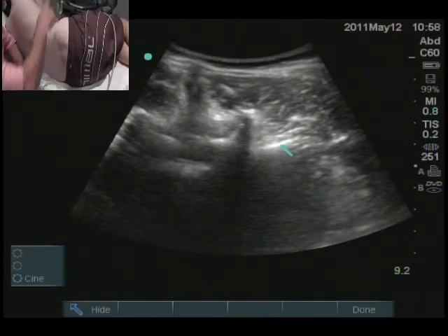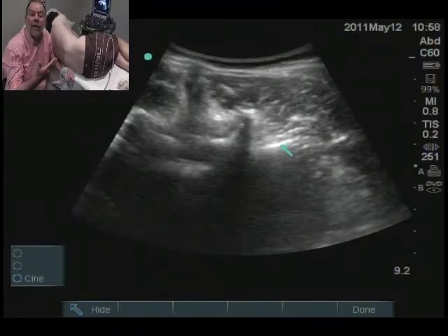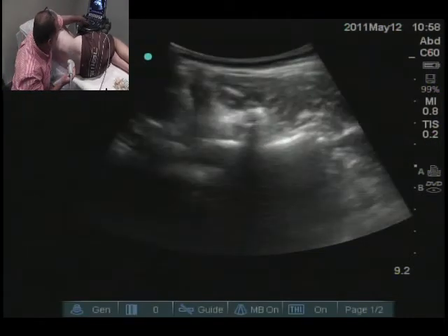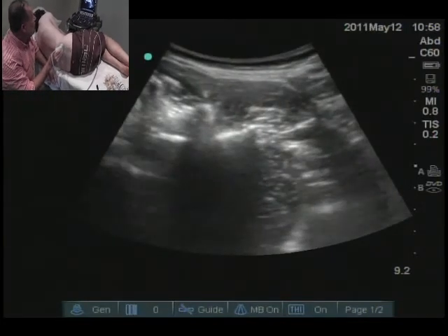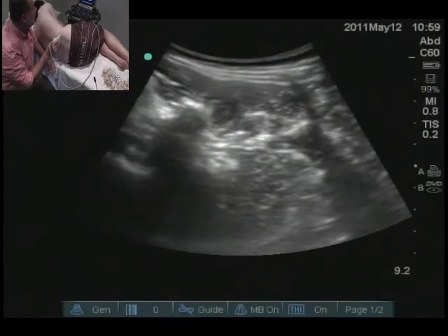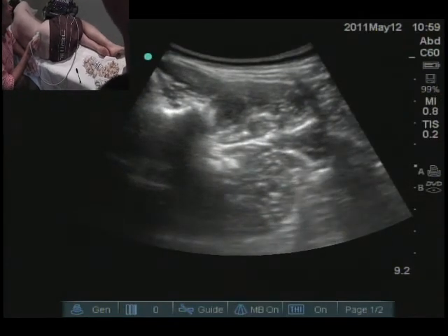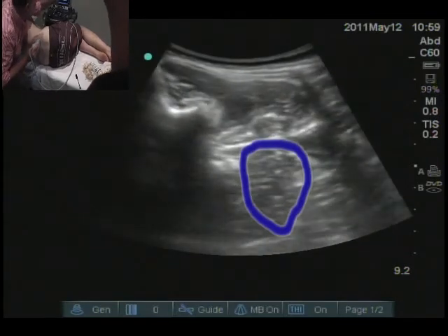So what we're looking at is we're trying to find the transverse process, because that's important for us. We don't want the neuraxial structures, we want the transverse process, because that's our landmark for these. Okay. So there's our lamina, and then as we scan up, you'll see that now we're looking between the transverse processes. Because what we can see now is the body of psoas muscle. This is the body of psoas muscle.